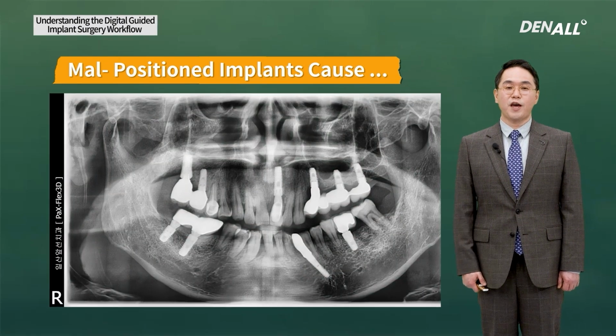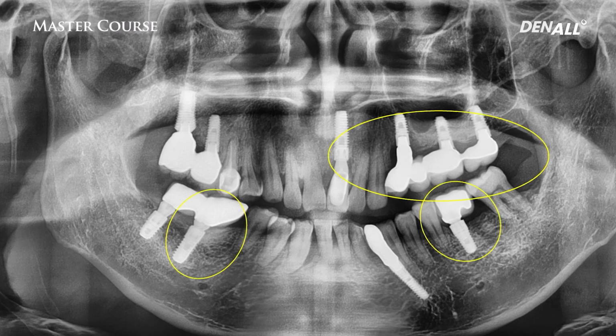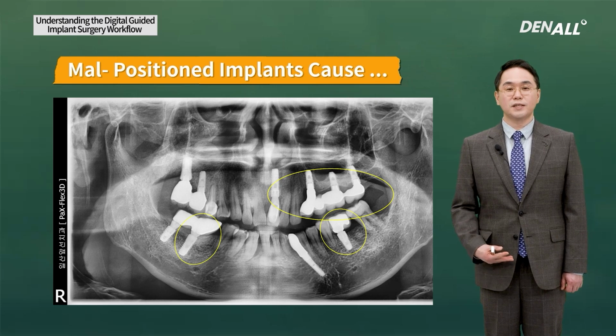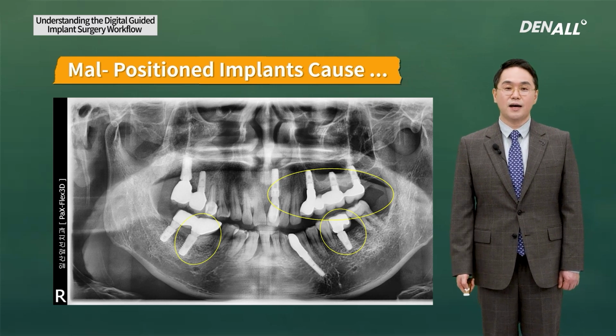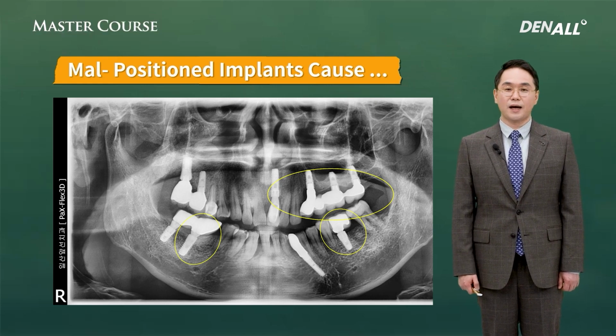lowering the long-term stability of an implant. Number 16 and 17, two implants, were placed in our hospital as the patient was referred to us, and other implants were placed in other dental clinics. You can see gingival swelling and bleeding as complained by the patient, and whenever the complaint came, we did maintenance care. But when a case has bone loss like this, the maintenance supportive periodontal treatment may not have a very good response, and the patient wanted to remove the prosthesis and have a new prosthesis, so we decided to remove the prosthesis and check the positions of the implants.